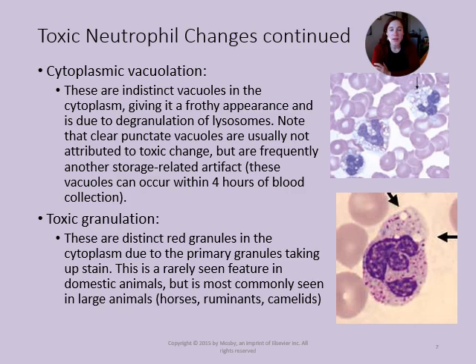And if they're ever clear and not necessarily foamy, it could be possibly due to a storage artifact. Also, it can occur within about 4 hours of your blood collection. Is it common? No. Is the storage issue common? No, because hopefully we're looking at our blood smear and looking at things before it's gotten to that point.